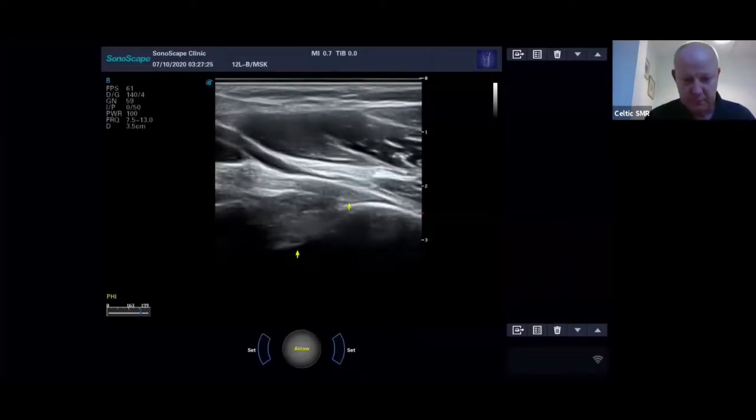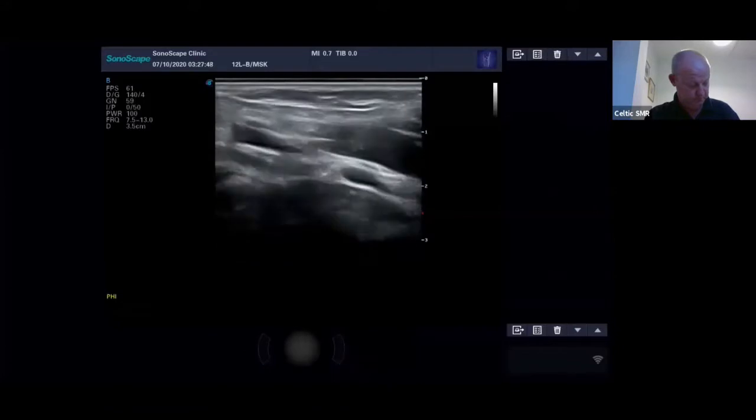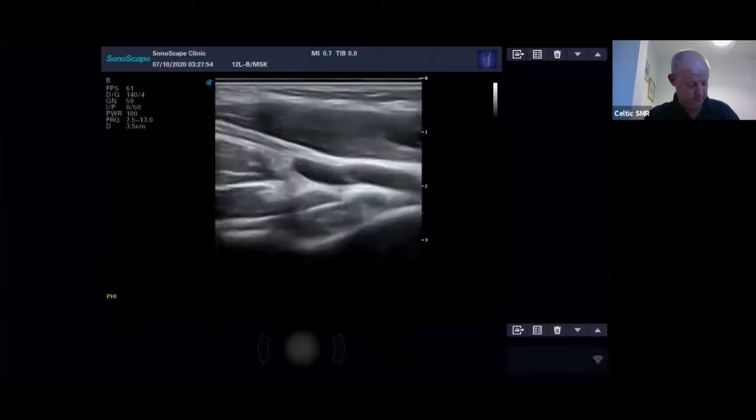This is the radial tuberosity here, and then this is the distal biceps tendon that's coming down here. It's actually a bit of short head and a long head. So the short head comes down and attaches a bit more distally, and then this will be the long head that attaches here. But it's quite difficult to make them out. The best way to make them out is actually not in the long section, but in the transverse section.